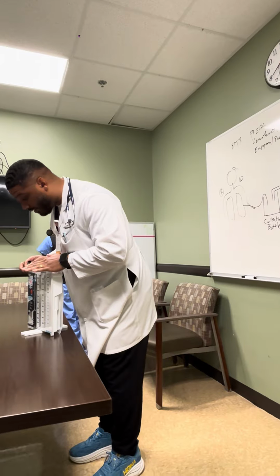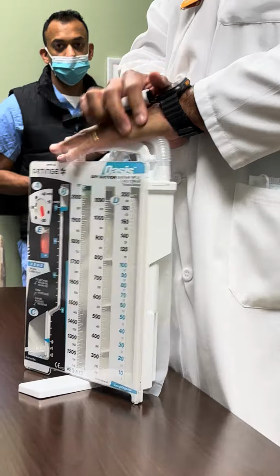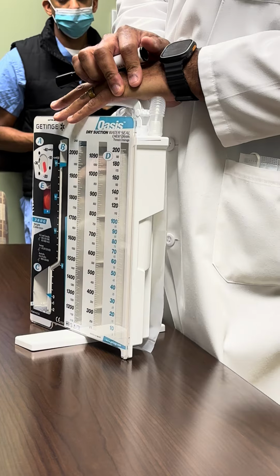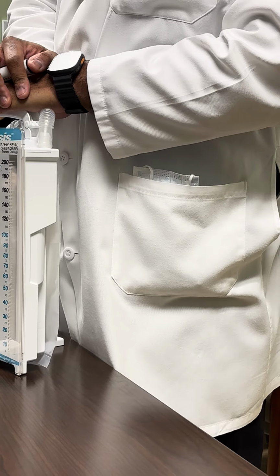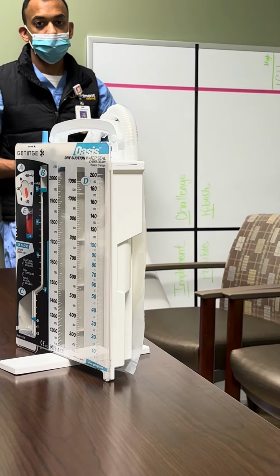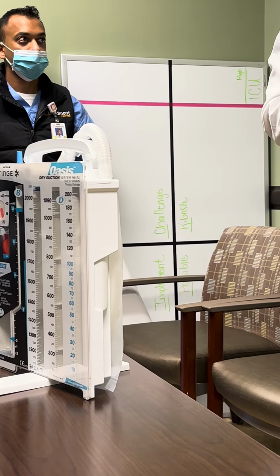So, there are actually 2 types of atriums. There are wet containers, and there are dry containers, wet and dry. Anybody think about why they call it wet and dry? What goes in the container? Is it wet or dry? True, right? But going back to the 3-bottle system, it really has to do with this 3rd bottle, okay?